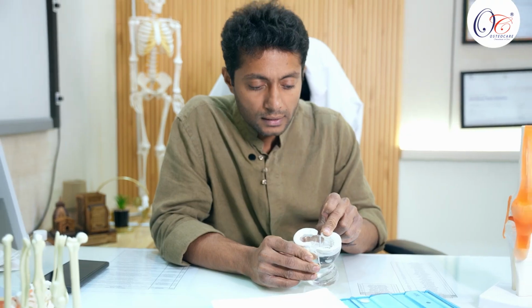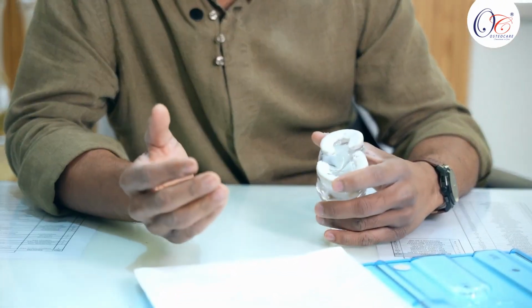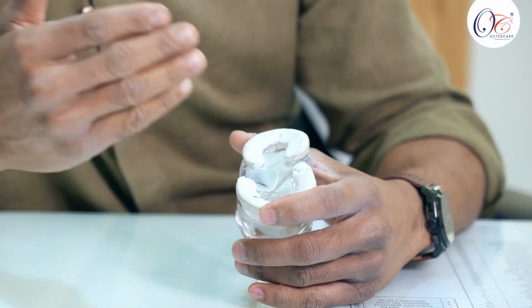The posterior root of the medial meniscus is very commonly injured in all sorts of injuries and also as a part of osteoarthritis. Traditionally, when the meniscal root is injured, we consider it very important because once the meniscal root is injured, the degenerative process accelerates and the tear in the meniscus will cause rapid acceleration in the osteoarthritis progression. So in order to stop this progression, we always try to repair the meniscal root, particularly in young people in whom the joint is not completely damaged.